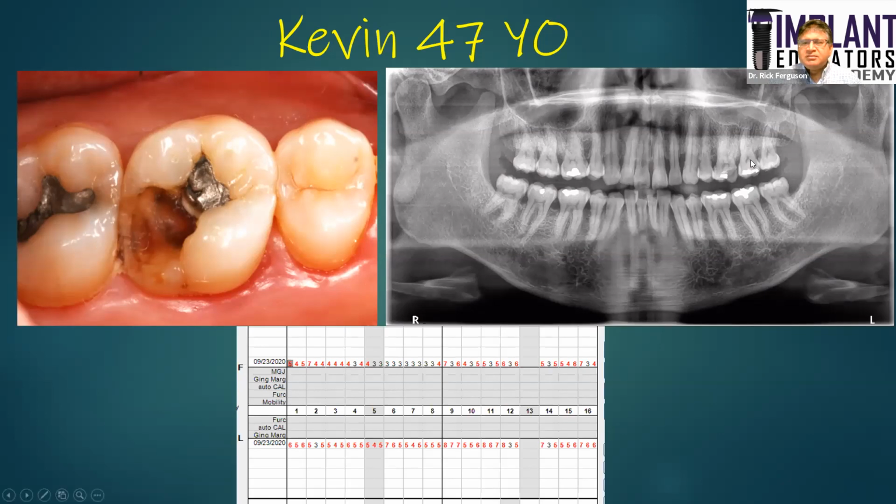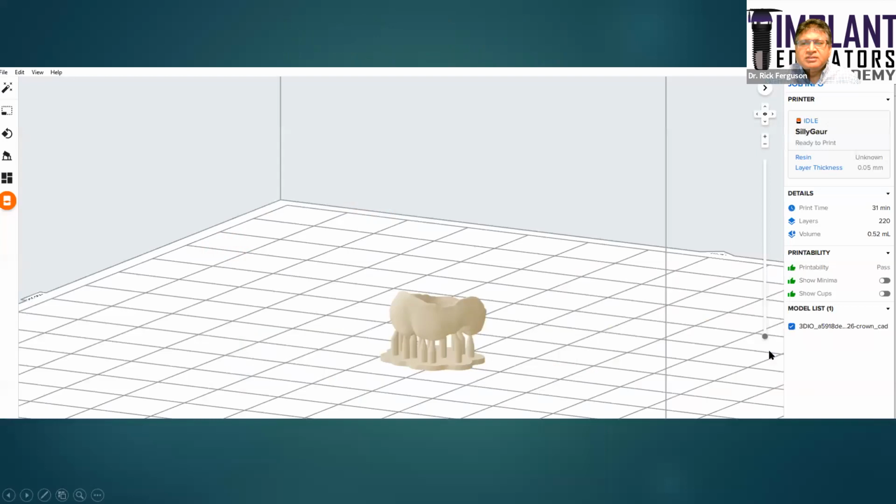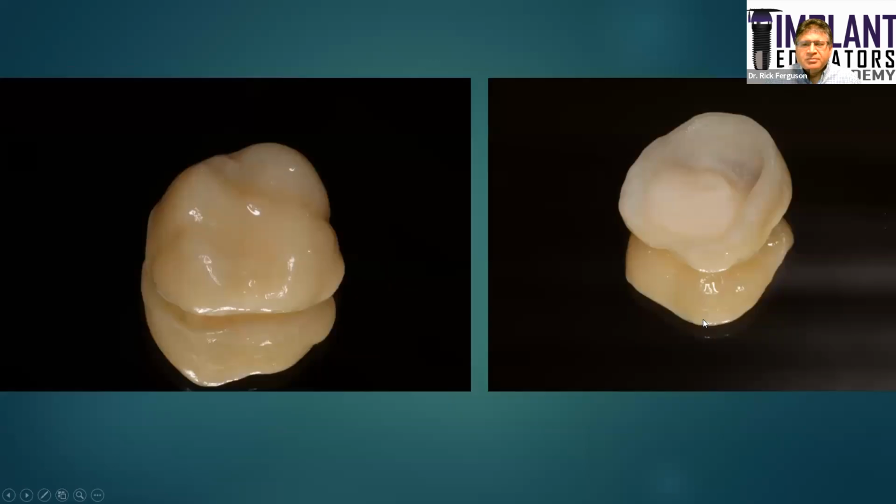This patient was going to go to the periodontist and have some periodontal work, but he had this tooth that was fractured. I didn't want to go to a final crown right away. So we actually used this particular resin on this patient, which we did a temporary crown. Actually, this was their permanent crown resin. They have two versions of this resin, the temporary crown and bridge resin and then the permanent crown resin.